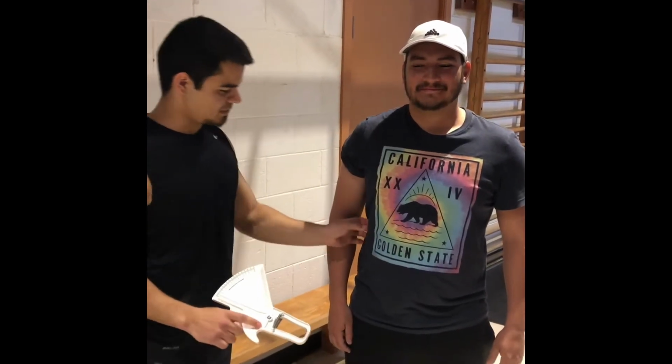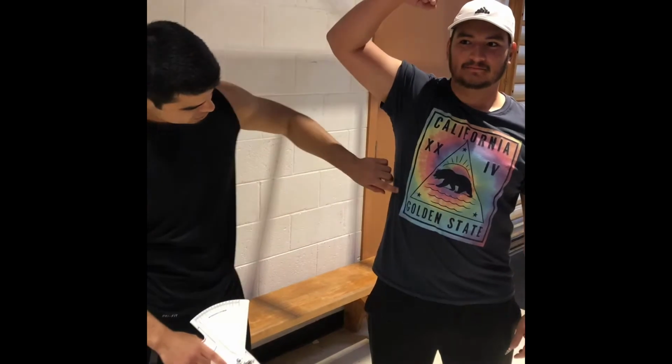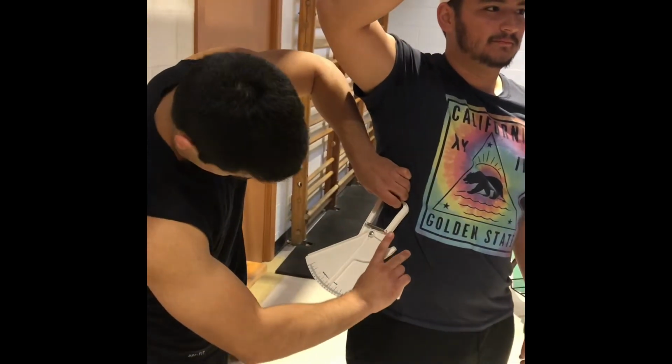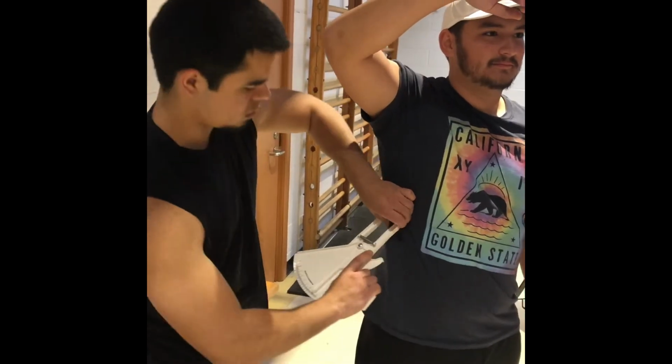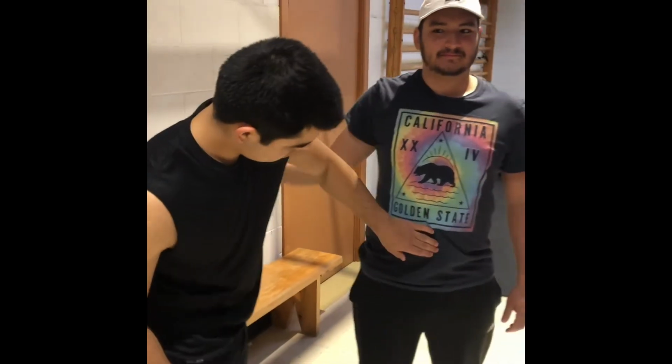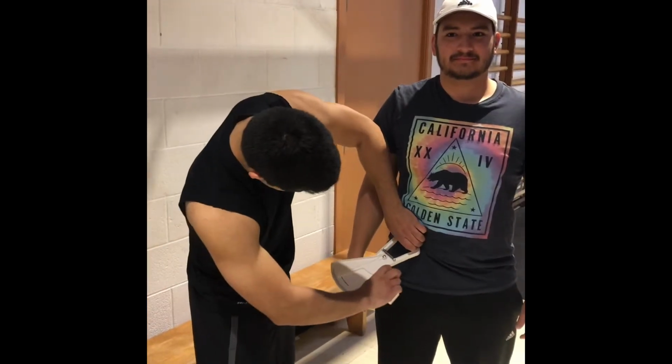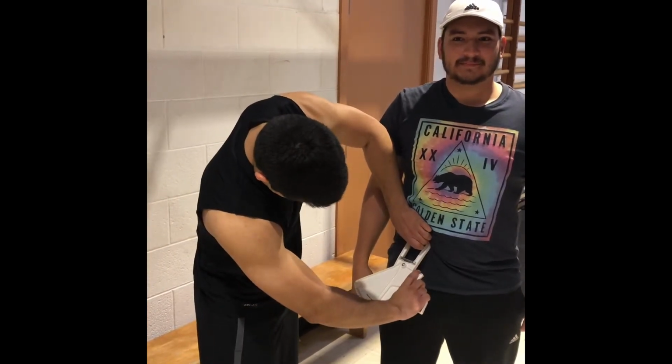Vertical fold should be done when measuring the mid-axillary, the abdominal, the thigh, and the tricep. The mid-axillary is measured at the level of the xiphoid process of the sternum. When recording for the abdominal skinfold site, remember to go 2 centimeters to the right side of the umbilicus to get an accurate measurement.